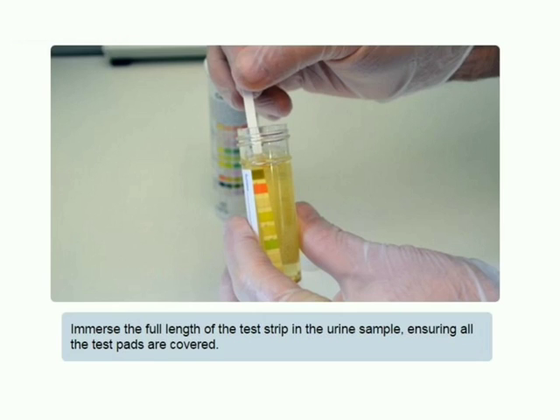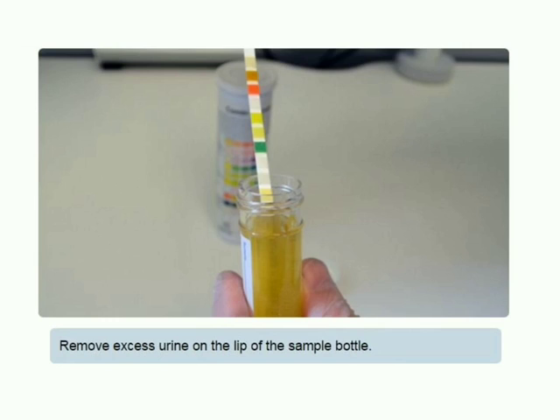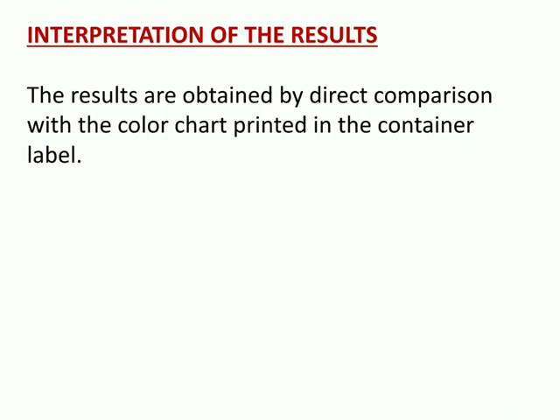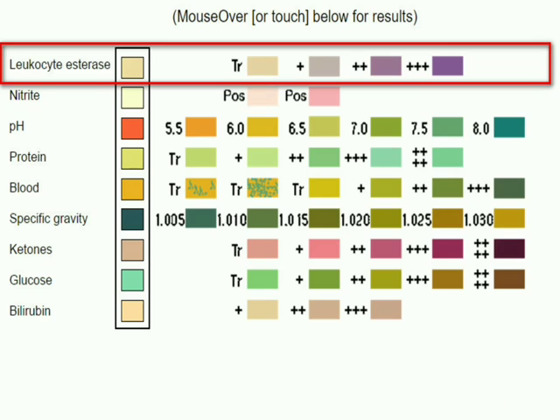Here is how we dip the dipstick inside the urine bottle. Immerse the full length of the test strip in the urine sample, ensuring all test parts are covered. Then remove the excess urine on the lip of the sample bottle. After the time is over, mark the color change and report. The results are obtained by direct comparison with the color chart printed on the container label — this is how the interpretation chart looks, with different color standards for every chemical parameter.